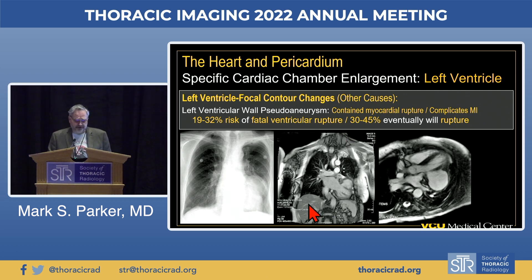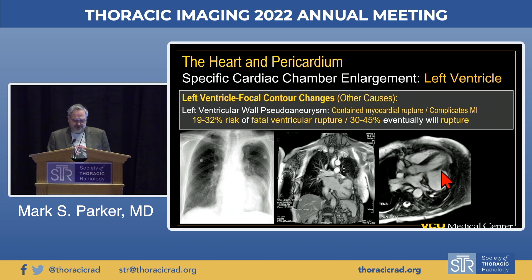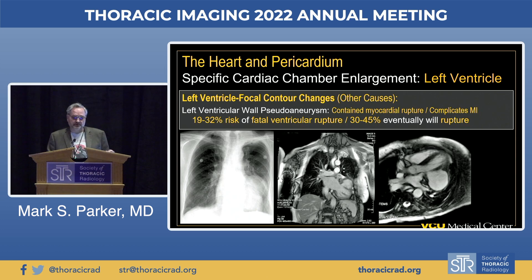A coronal white blood MRI image, equivalent to our frontal radiograph, shows the contour change created by the post-infarct pseudoaneurysm. On the three-chamber view with RV, LV, and outflow tract, we can see the pseudoaneurysm protruding posteriorly. It's important to recognize this on the radiograph and refer the patient appropriately, as these carry a very high risk of rupture and death if not treated.